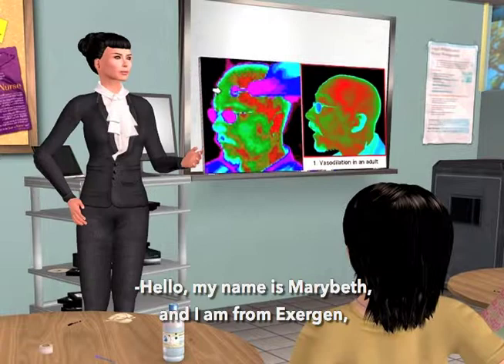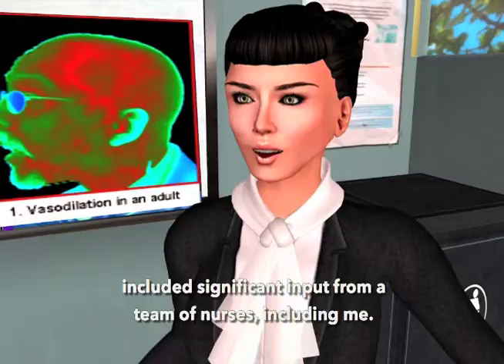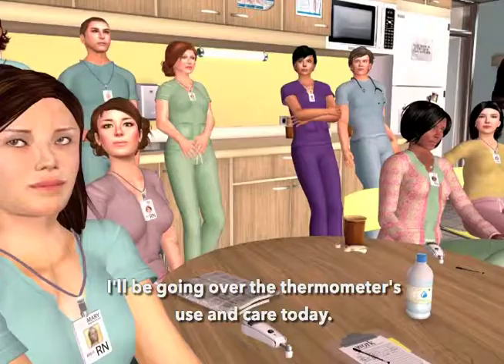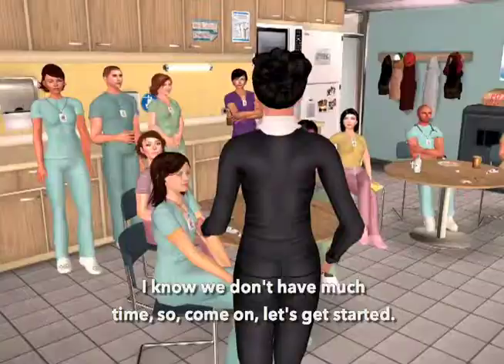Hello, my name is Marybeth, and I'm from Exergen, the company that invented and makes the temporal artery thermometer, right here in the USA. You'll be happy to know that the development of this thermometer included significant input from a team of nurses, including me. I'll be going over the thermometer's use and care today. We don't have much time, so let's get started.